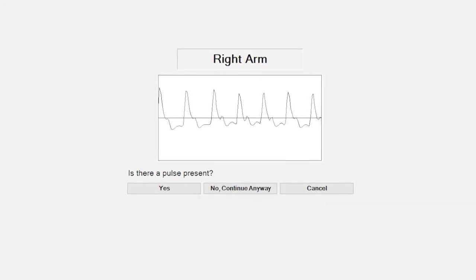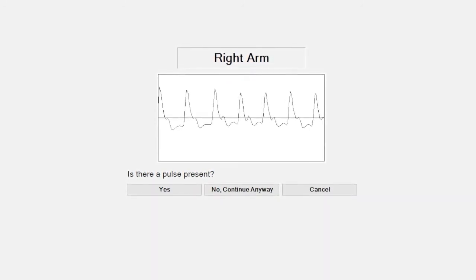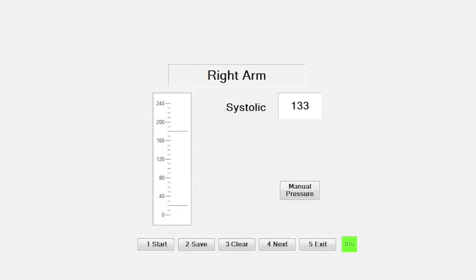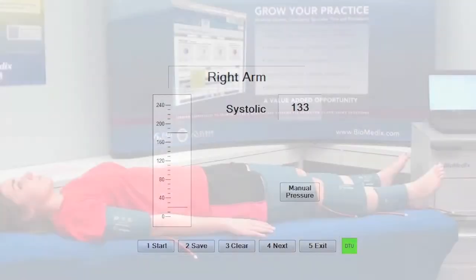If you do not have a PPG probe, you may skip the affected portions of this test. Upon confirmation, the system will record the air pressure for this location using air cuff technology.